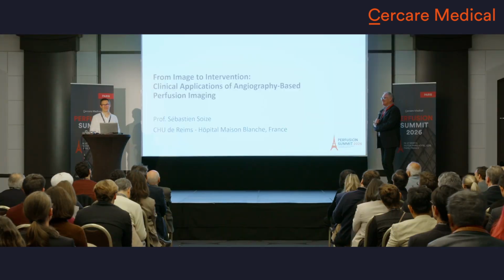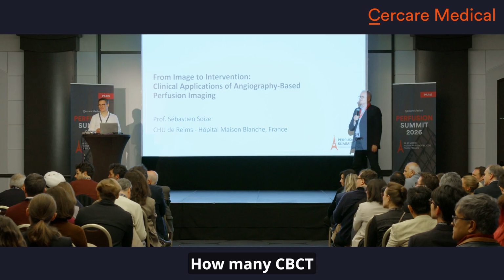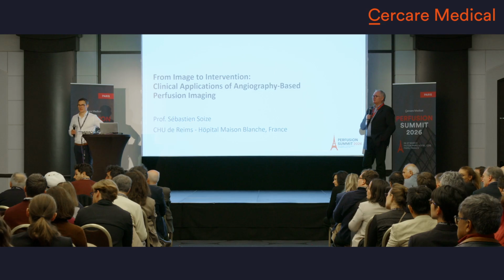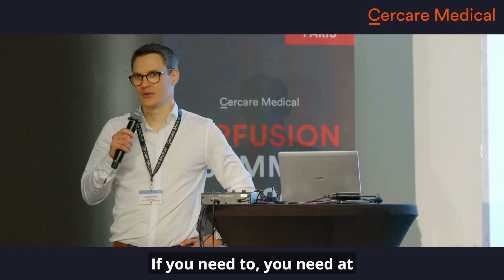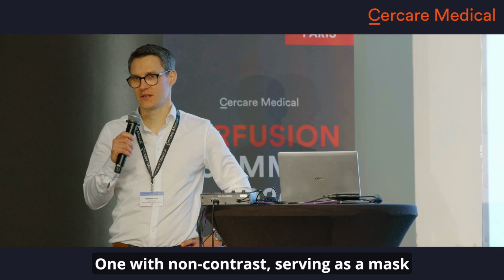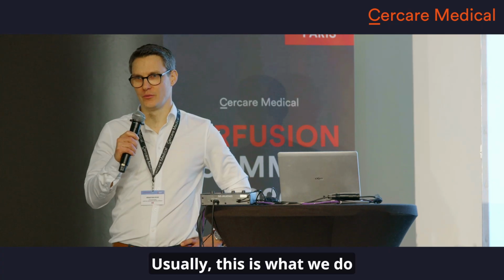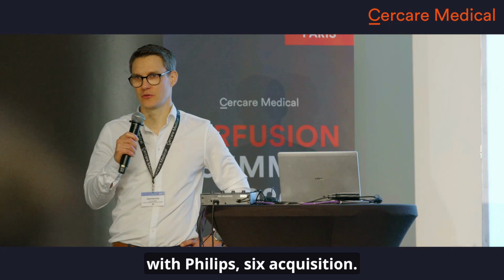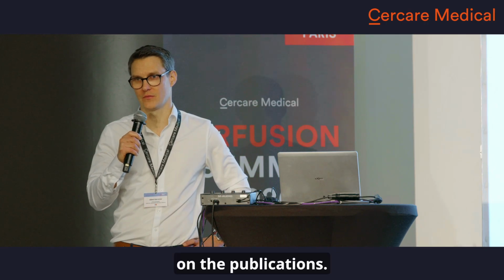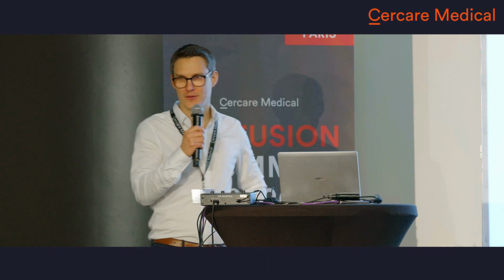Right. Thank you. I think there's a question there. How many CT acquisitions are required? You need at least six acquisitions: 1 non-contrast, serving as a mask, and 5 with contrast. Usually, this is what we do with Philips, 6 acquisitions. With Siemens, they do 11 acquisitions normally in the publications. So it's far more reliable.